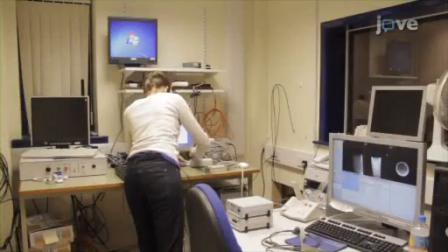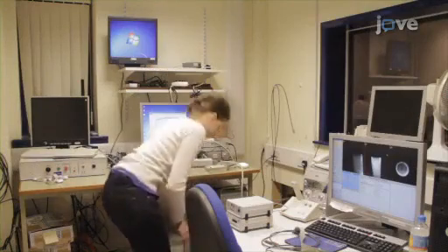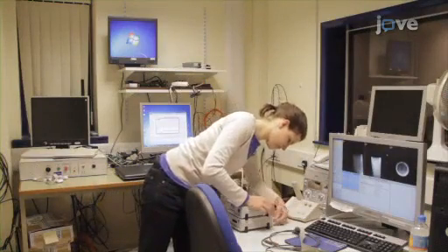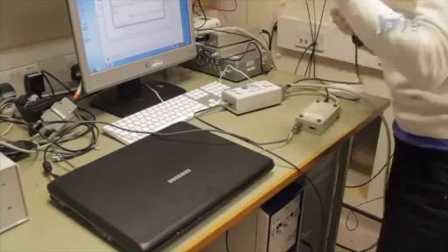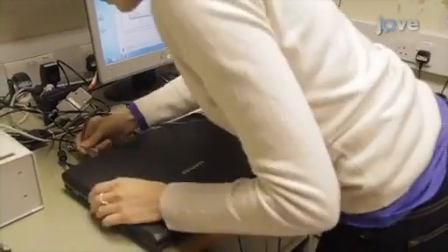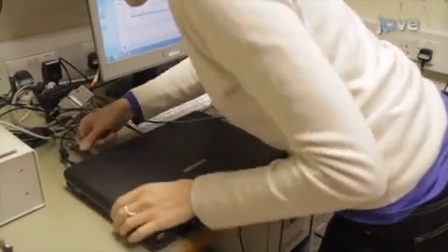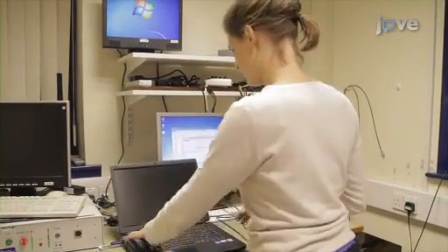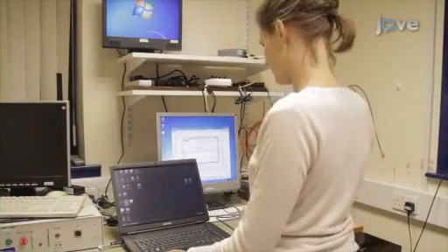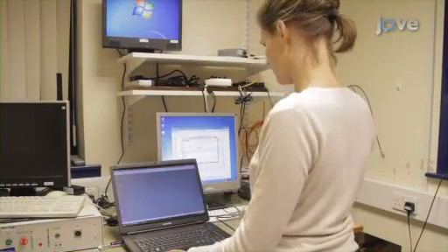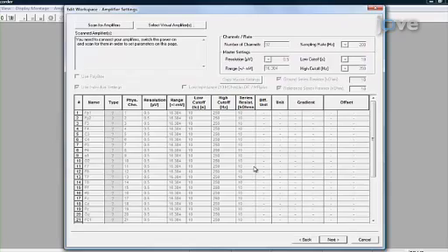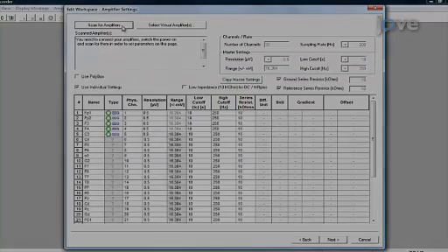Prior to the subject's arrival, set up the EEG equipment in the control room where the scanner operator will sit. Connect the laptop computer to the EEG. Turn on the computer which will record the EEG data and open Brain Vision Recorder. Make sure the workspace for recording the data is set to the highest available temporal resolution.